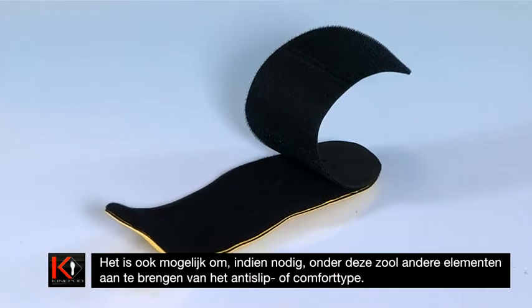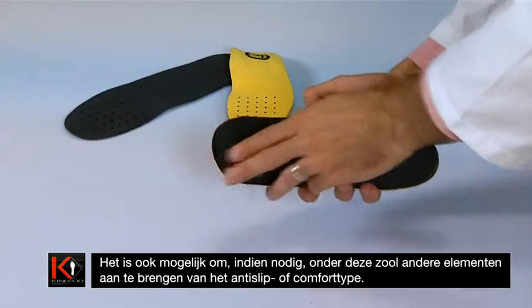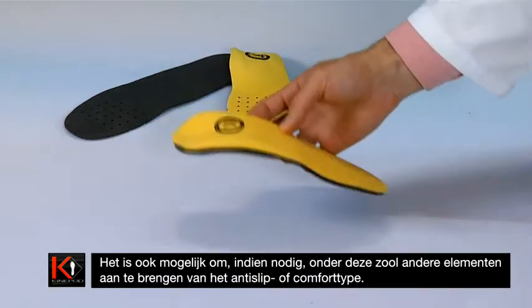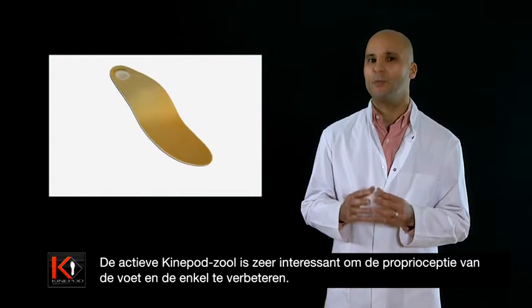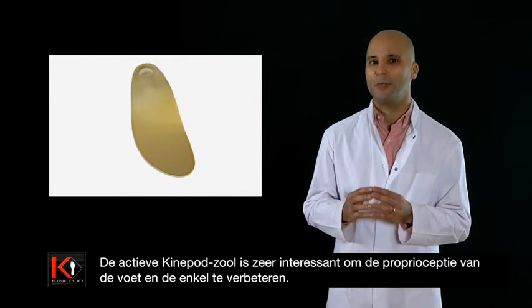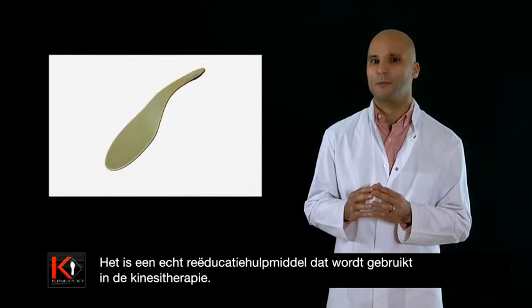It is also possible to add other items under the sole, such as anti-slip or comfort-related options as required. The active Kinopod sole is of particular interest for improving proprioception in the foot and the ankle, and is a real re-education tool used in physiotherapy.